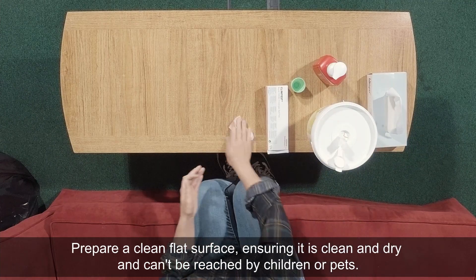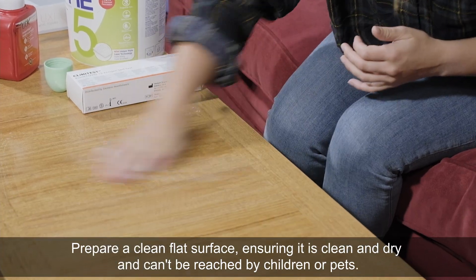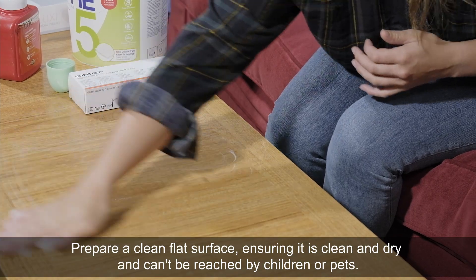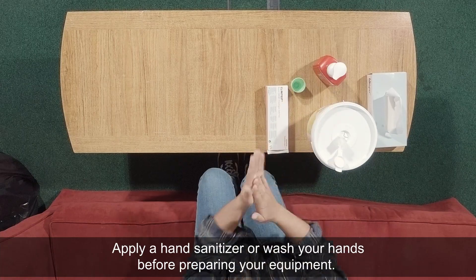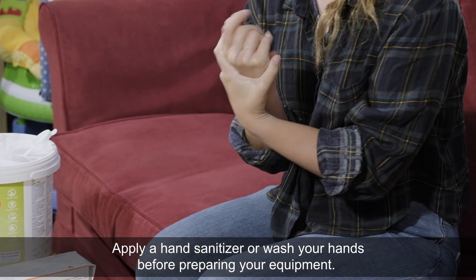Prepare a clean flat surface, ensuring it is clean and dry and cannot be reached by children or pets. Apply a hand sanitiser or wash your hands before preparing your equipment.